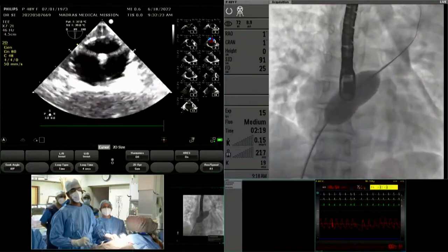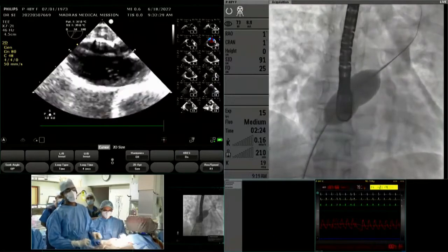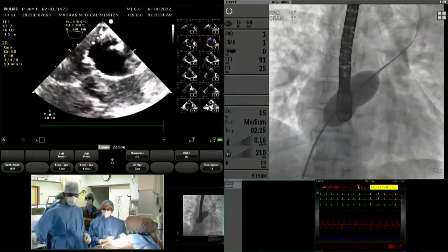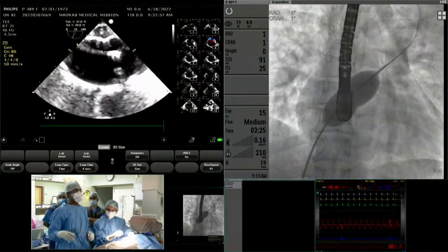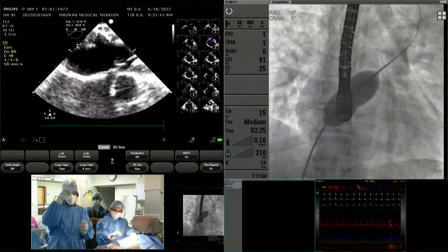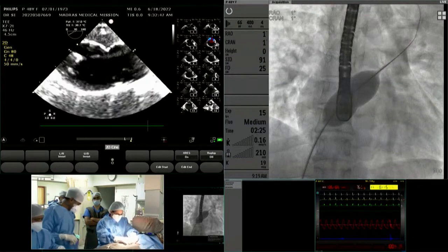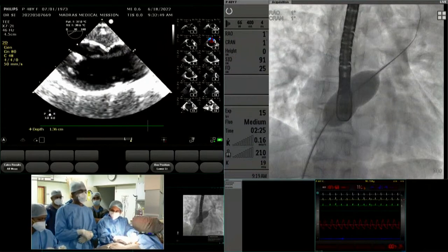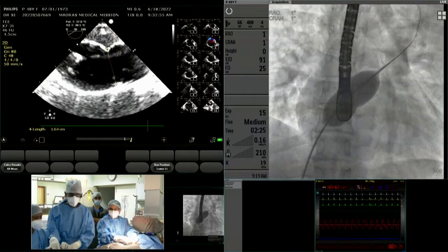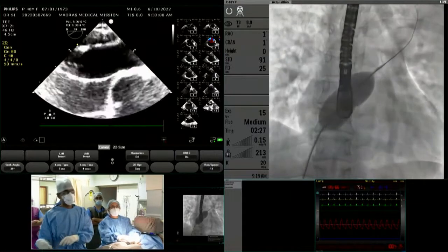This is number one. Number two, in the majority of the patients where there are double ASDs, the atrial septum is slightly floppy, and hence they tend to have more stretchability, because the basic nature of a double ASD itself is because of extreme floppiness of the septum. In fact, fenestrated septums are even floppier. Multi-fenestrated septums are even floppier. So the advantage is that we will not twice cross the same defect. And number two, we'll be able to assess the floppiness far better.